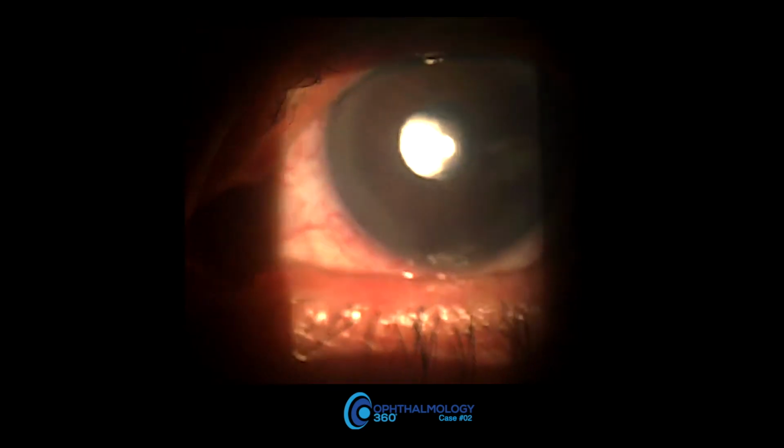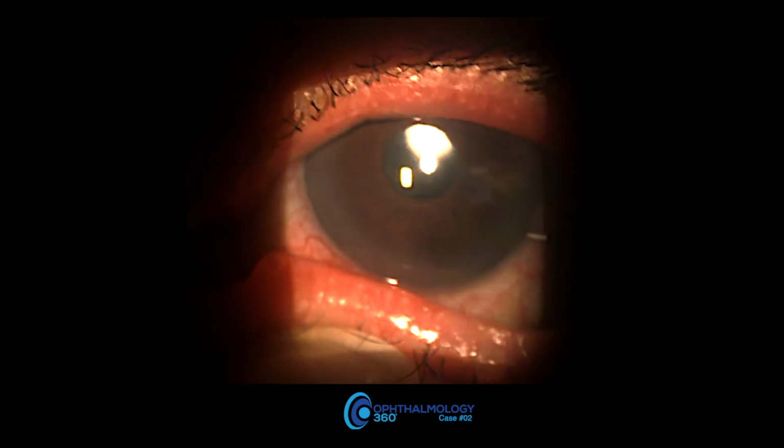These are done at the slit lamp. You can do them supine as well. I don't use a speculum. I think the patients are much more comfortable that way.